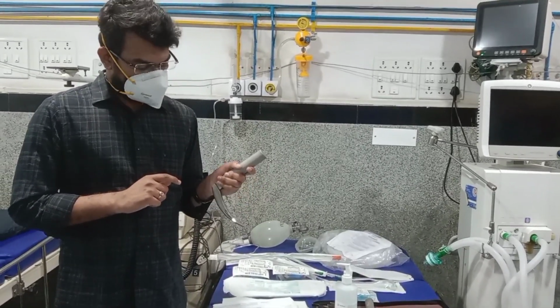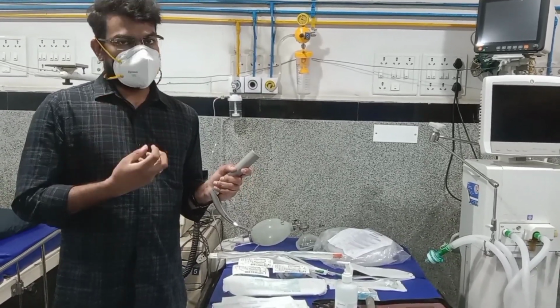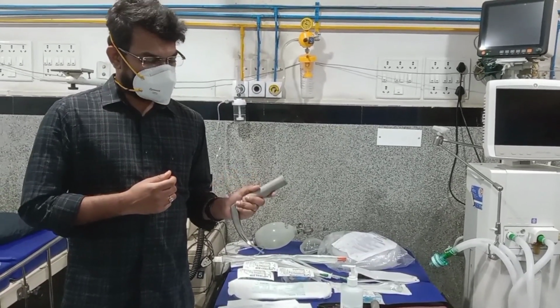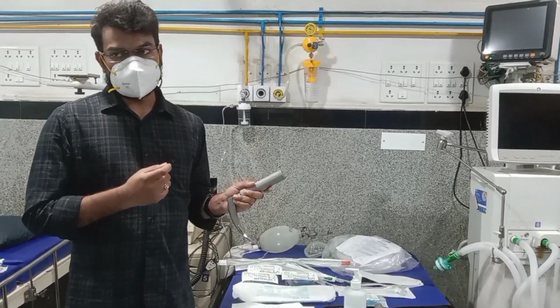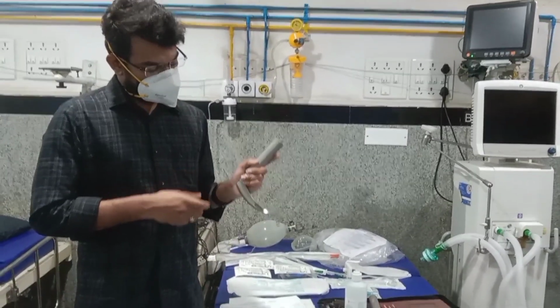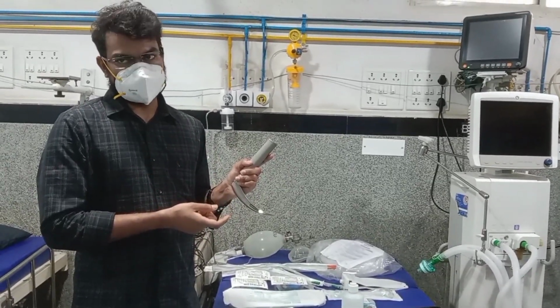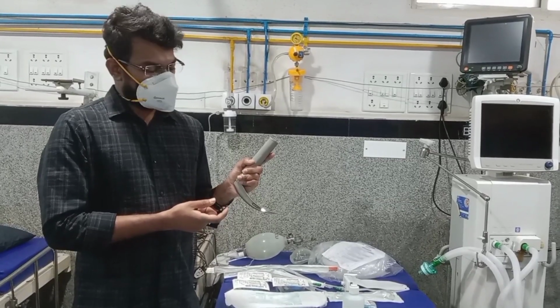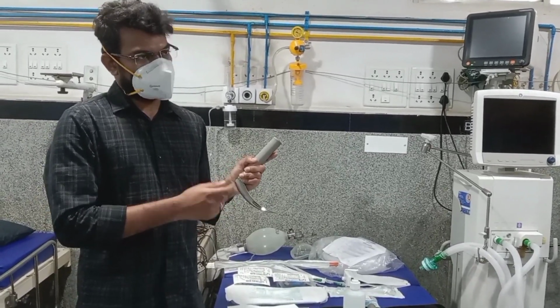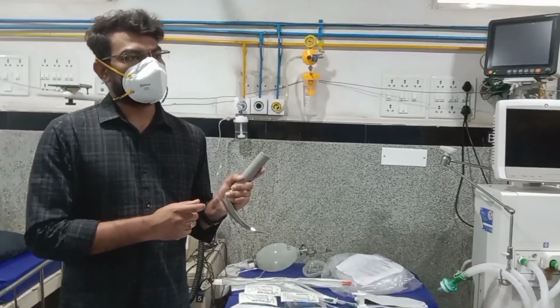Once you put it in, we should make sure that we see the trachea after reaching the epiglottis or glottis, whatever we lift. Once we lift the chin, we find the trachea behind the glottis. Once we see the trachea, we can clearly visualize it by its movements.